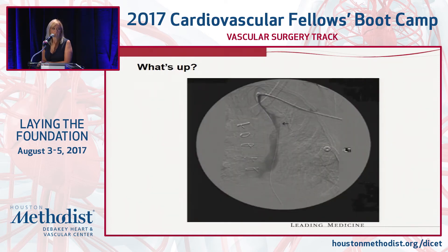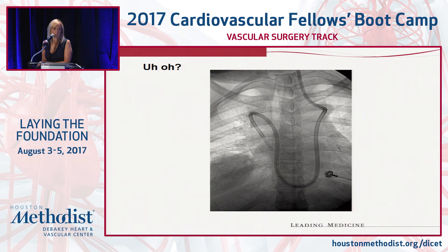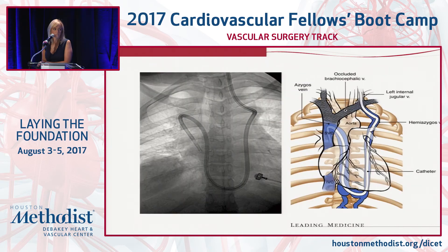Where is your catheter here, where is your wire? It's in the hemi-azygous vein. This catheter went from the hemi-azygous vein back up the azygous and then into the SVC. Is this an acceptable placement? It's actually fine — as long as the tip of the catheter and the two end holes are in a high-flow vein, in this case the SVC, you're going to be okay. This is a surprisingly acceptable placement. You can trace it down through the azygous, up into the azygous, and into the SVC.